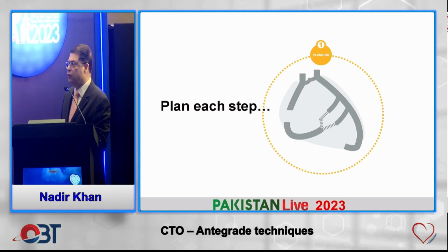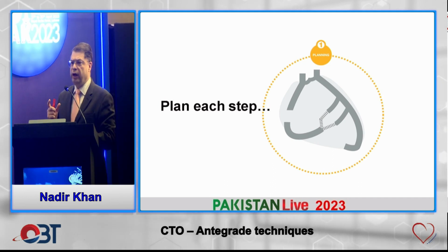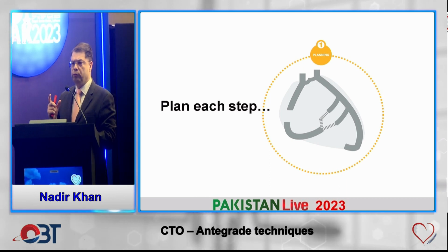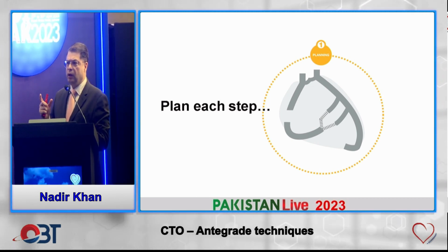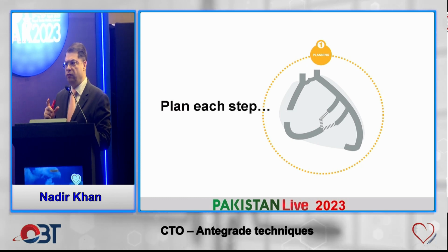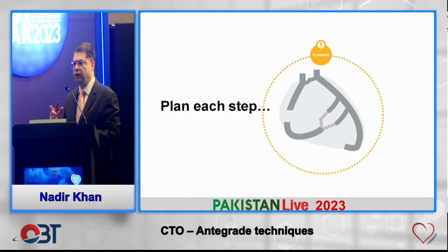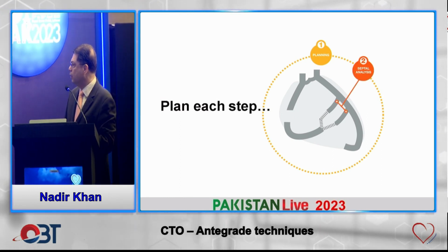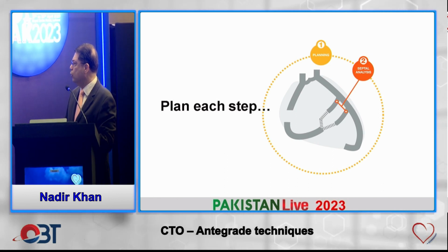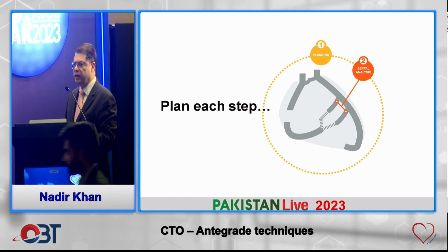Now planning is the most important thing. You need to watch the angiogram for at least 10-15 minutes. When you initially see the angiogram, and what you see after 15 minutes, is totally different. So you need to really understand the anatomy and the various collateral channels. Then you do the septal analysis, which septals are connecting.